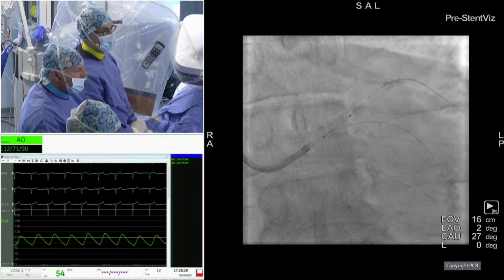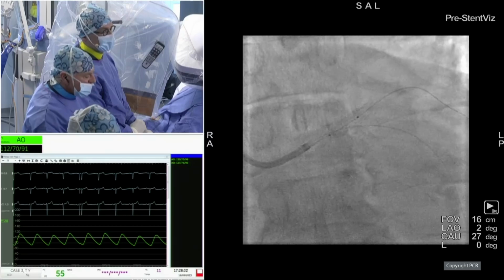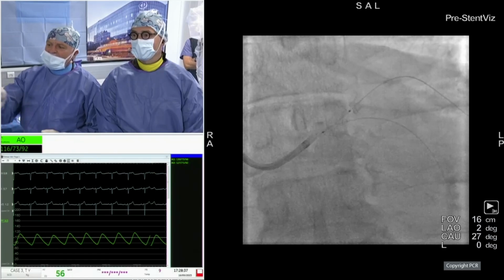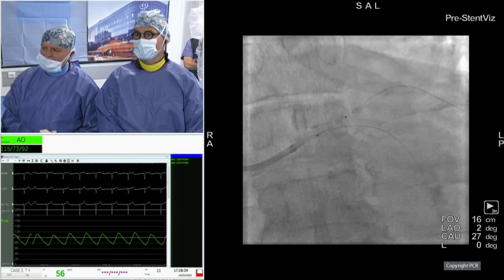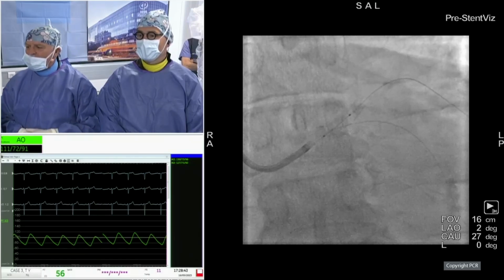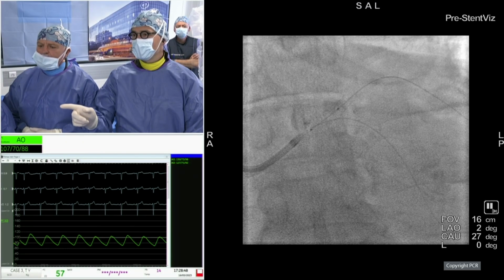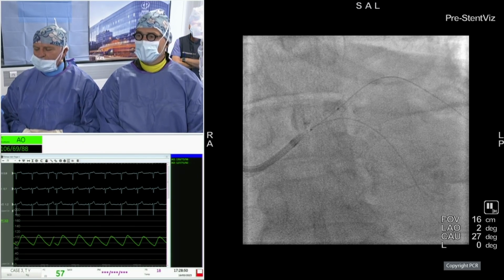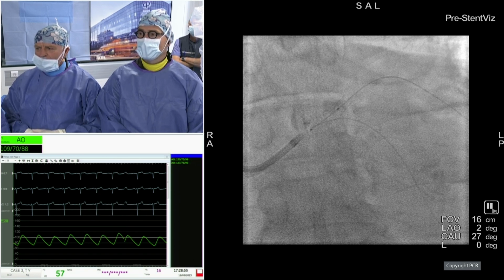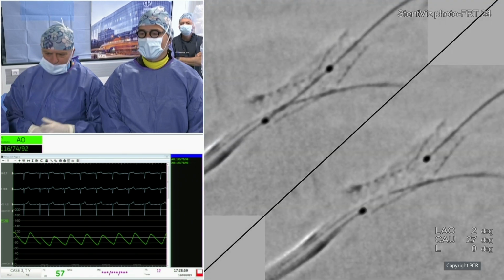So just to explain what we have done, we did the pot with a 4.5 millimeter balloon, and just after we did a stent enhancement acquisition. As you can see, I think you can see the stent enhancement. Did you see the stent technology? So you can see that the stent is... Can we show the stent view, please? The stent technology on the right, stent view, there, perfect.